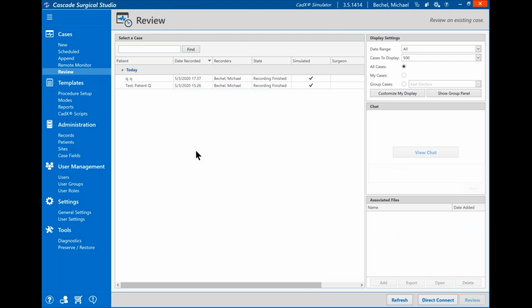Well, how is that helpful? Well, in a number of ways. First of all, it gets it off your device automatically, so you don't have to copy and move it to a server or copy it to another location, unless you're using an offsite provider that you still may have to export it at that point. But if you're not using that external provider, all this data can be archived in something on a server that you can manage.